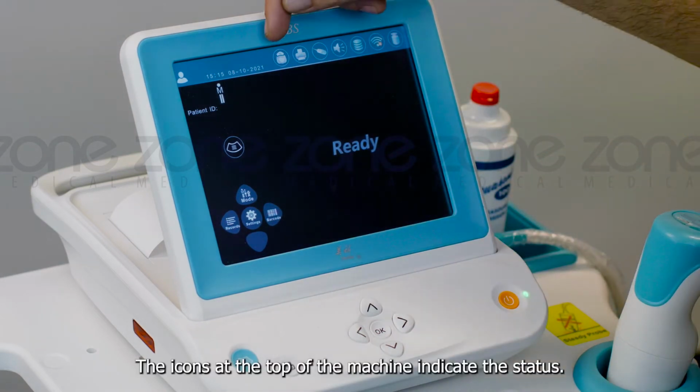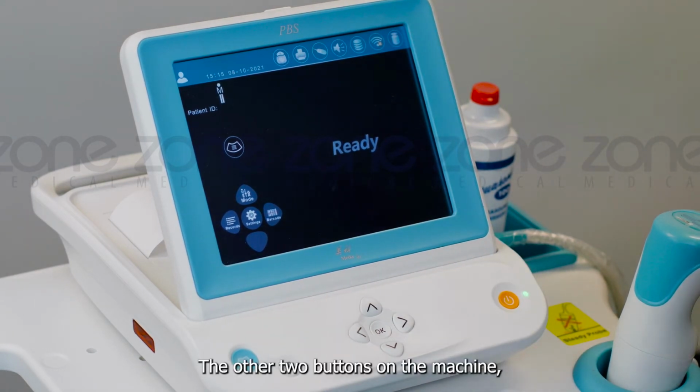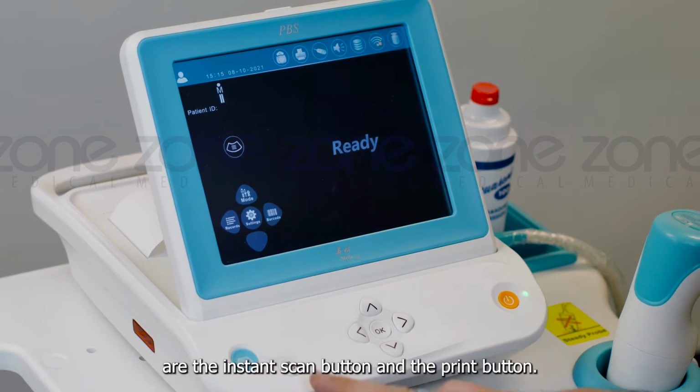The icons at the top of the machine indicate the status. The other two buttons on the machine are the Instant Scan button and the Print button.